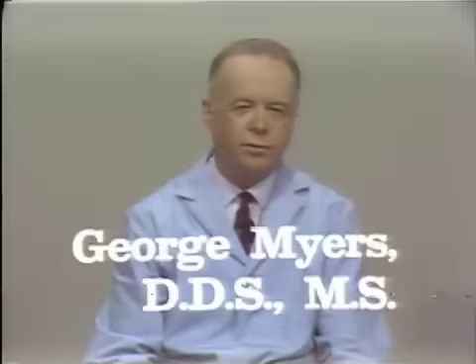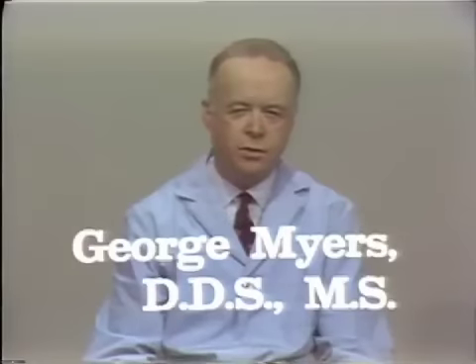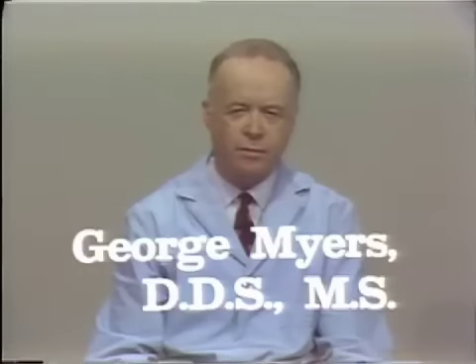The important thing to remember is that whatever type of pontic is used, the same basic principles of design apply. And perhaps one of the most important things in the whole business of constructing bridge pontics is to have good communications between the clinician and his technician. And as a clinician, one should always make sure that one sends to the technician the maximum amount of information on just exactly what you want. This will make for the most effective end result.